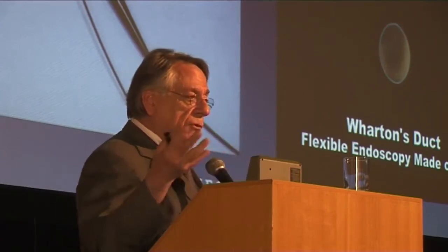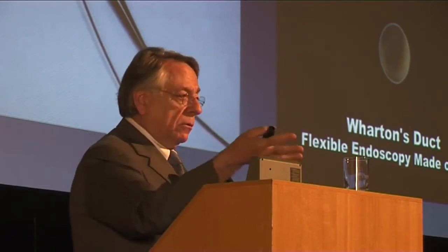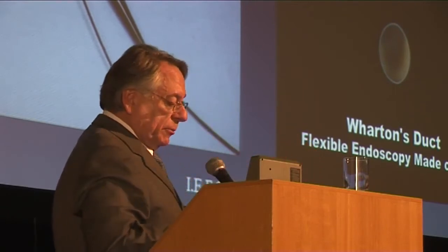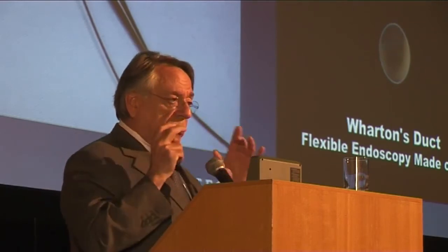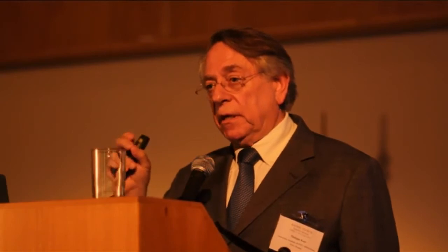If you have seen the view before, like the view from Hodel, Pasquale, or Johannes also, it's very big now. Before, it was like this, because it was not with the computer, it was just the view. And with the view, we could see the dark stone like this, and we could make the first analysis of the inside of the salivary gland.